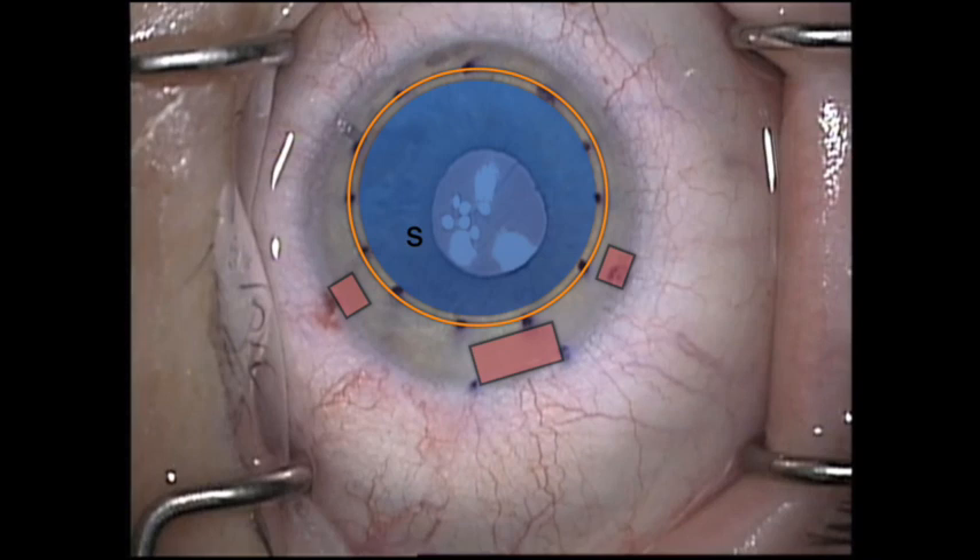This diagram illustrates what I feel is the appropriate layout for a DMEC surgery. The red areas represent the incisions and the yellow area represents the area of the Descemet's scoring. The blue area represents the DMEC graft and shows that there should be no overlap with the host Descemet's membrane nor with the incisions. Friedrich Kruse was the first to report the importance of avoiding overlap of the DMEC graft with the host Descemet's, and I cannot thank him enough for this contribution as it has helped me and my patients immensely.